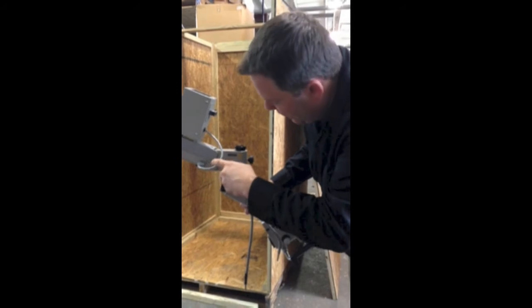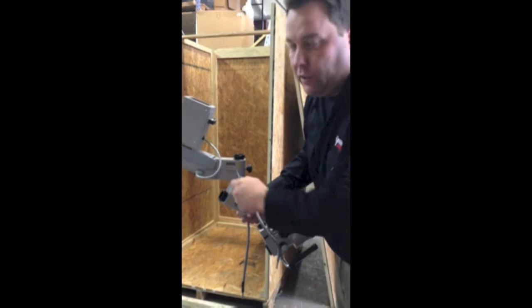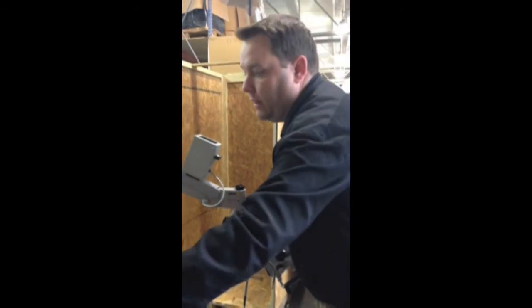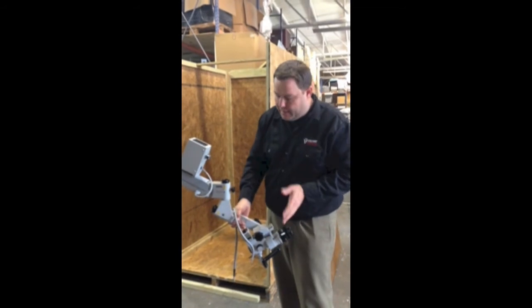There's a channel on the shaft and you want to make sure it touches — you'll feel it stop moving. Then just give it a little bit of a twist. You don't want to ever over-tighten it, but just until it touches. You'll feel it touch, then give it a little twist more to make sure it's nice and tight.